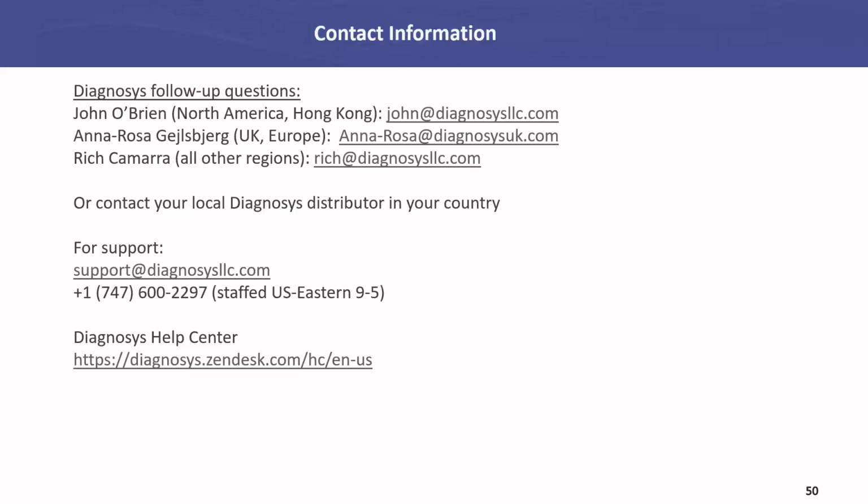So the range is about 9 orders of magnitude in white, and where the top and the bottom is depends on whether you've got the dims, the standards, or the brights. I can give you more precise numbers, but I don't have the brochure in front of me. I think that was a good summary, Natalie. If someone wants more specific information, definitely check with our sales team or the distributor in your country, and they can give you our Celeris brochure, and you'll have exactly those numbers.